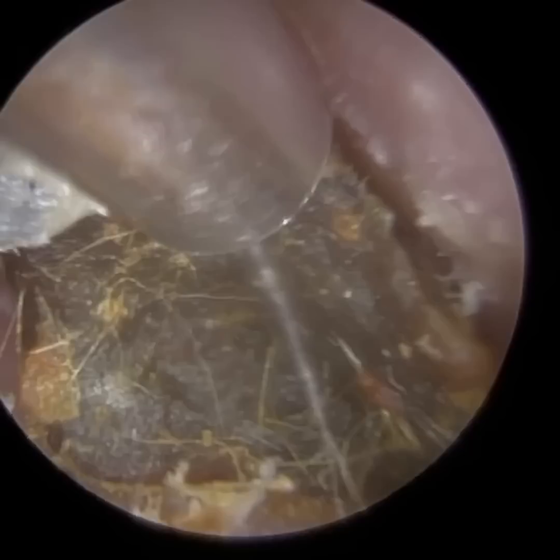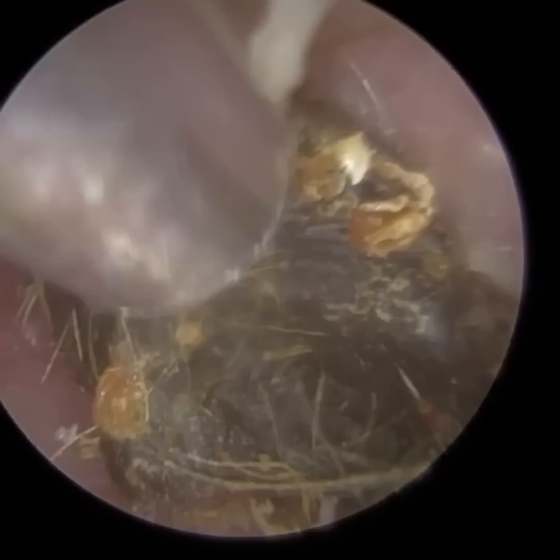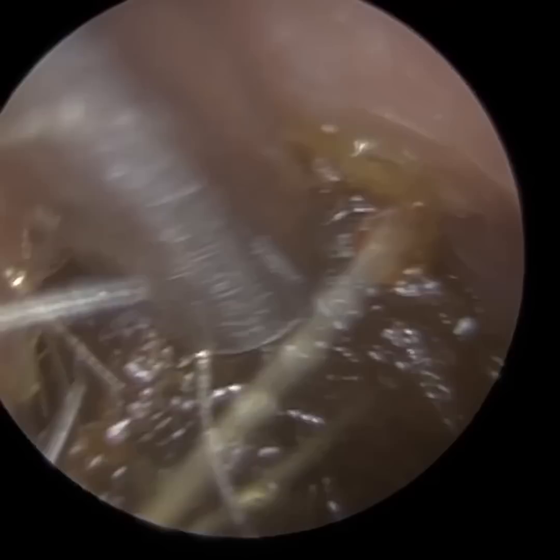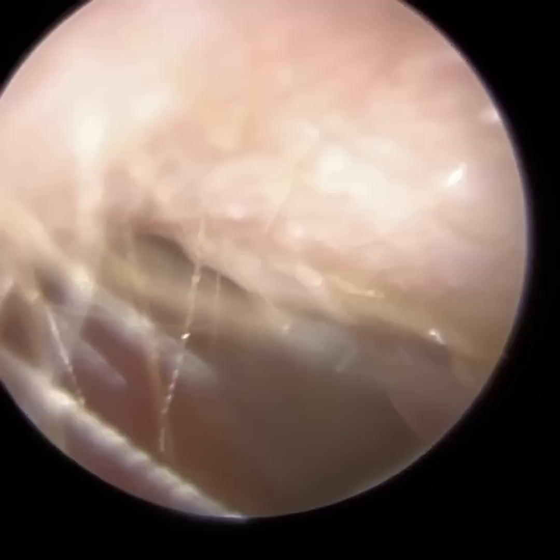So I'm being extremely gentle, just trying to loosen and detach this. Sometimes when you get a dry plug of wax like this, it's very hard to get a suction grip because it's just too dry and matted. Quite often when ear wax has been pushed in the ear, there are also a lot of hairs. So I've just put some olive oil to help get a suction grip, suctioning the excess — the oil sometimes just softens the surface enough so the sucker can grip. And there we are — we can slowly but surely remove this one. There's quite a large plug there. I'm just going to re-enter the ear. There are a few bony spurs, but it's not as pronounced as their left ear.